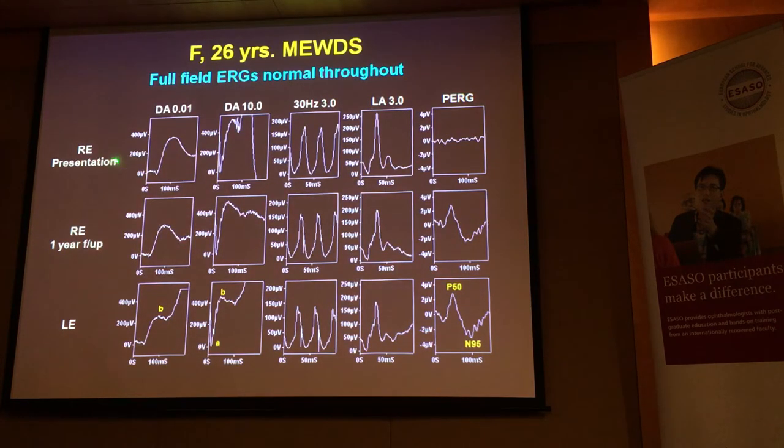And the ERG is completely normal at the beginning. Pattern ERG undetectable. One year later, ERG remains completely normal. Pattern ERG recovers. This patient was not treated.